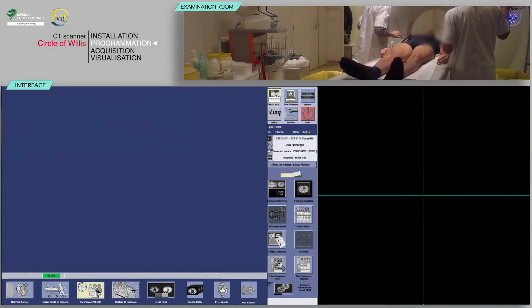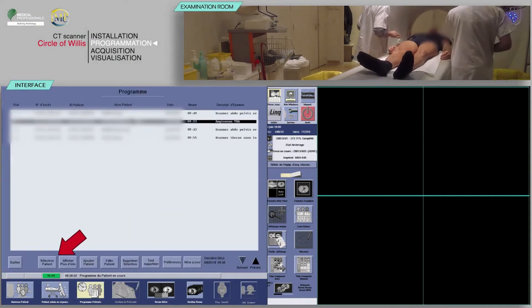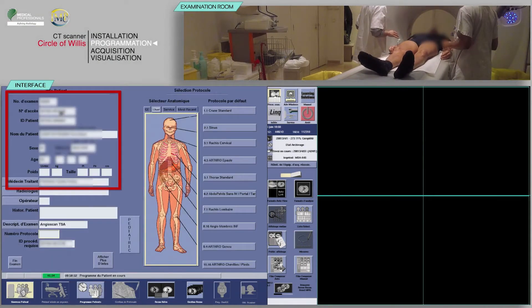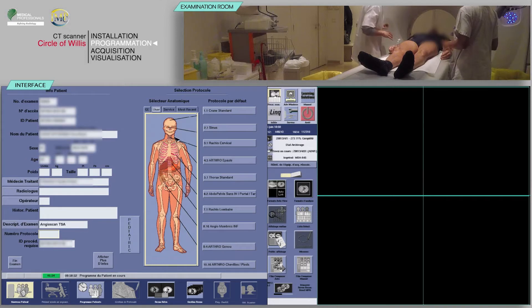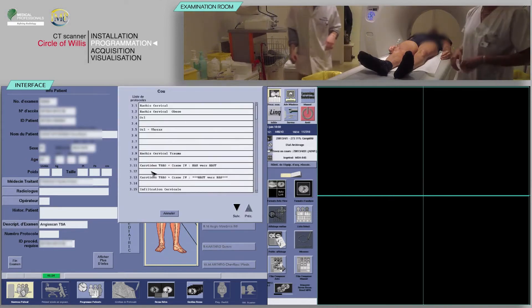Select your patient from the worklist, then click on patient selection. Verify that the pre-filled information is correct and fill in your patient's weight and height. Finally, choose the appropriate protocol.